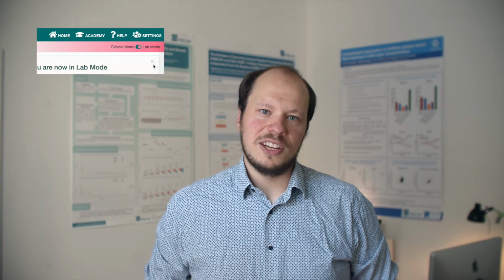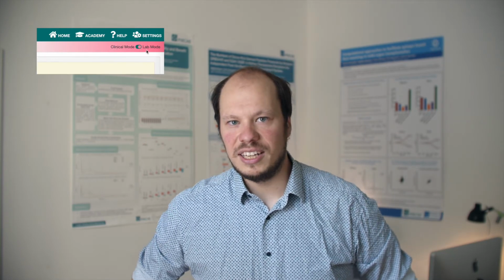So an important thing I want to mention here is that on the top right corner of the PIRCHE application, there is a switch for the clinical mode and the lab mode. And in the lab mode, you get features enabled that aren't yet part of any publication. So if you really want to use the latest features, switch to the lab mode.